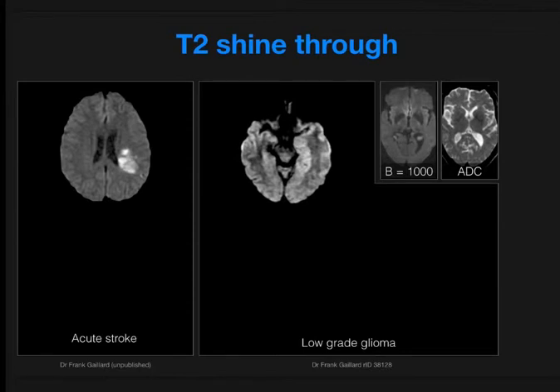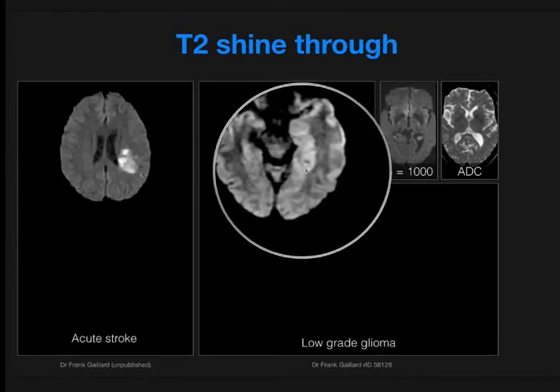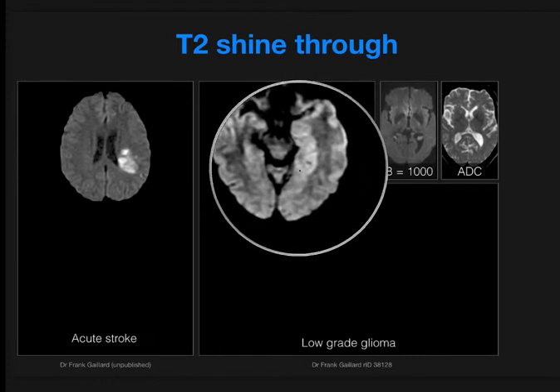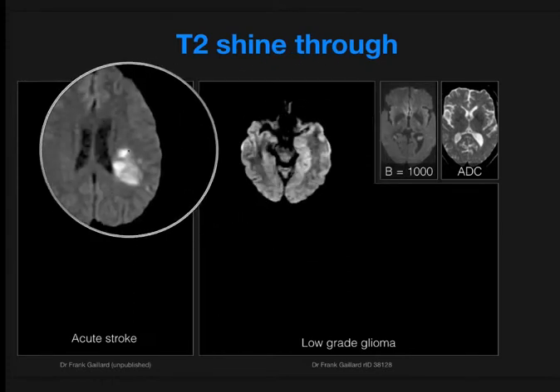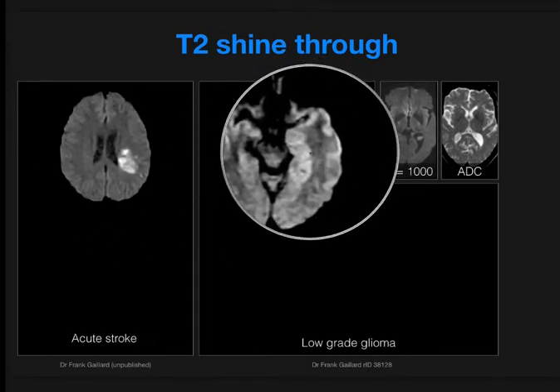Putting aside normal images, we should talk about the concept of T2 shine-through. There's a lot of confusion around what this means, but most of us know that trying to interpret DWI or B1000 images in isolation can lead to difficulty distinguishing true restricted diffusion from T2 shine-through. On this side, we have an acute ischemic stroke with very high DWI signal, and here a low-grade glioma demonstrates some elevation of signal. In the glioma case it's hard to know, because gliomas can demonstrate variable diffusion restriction depending on cellularity and grade.